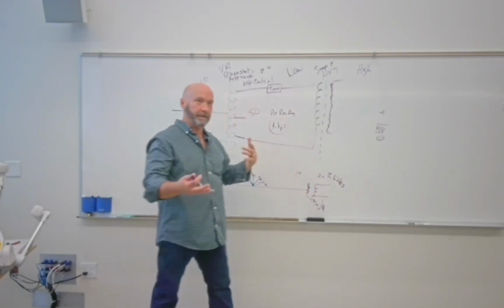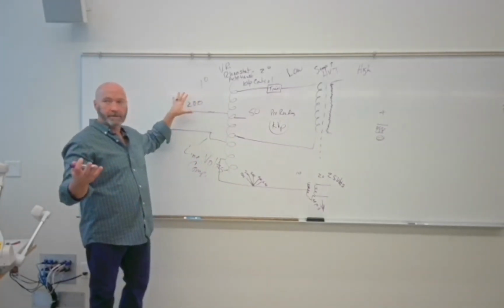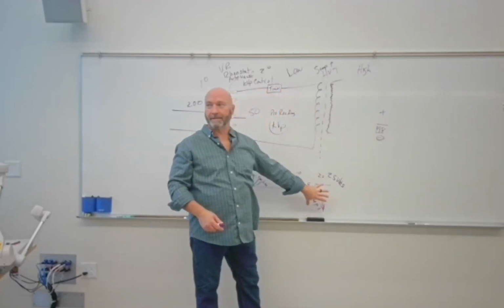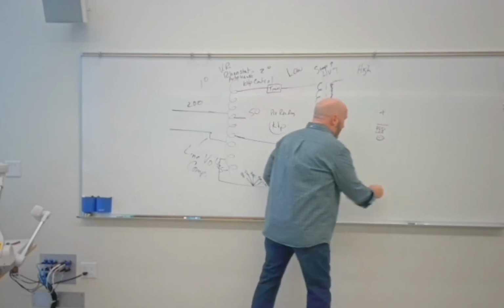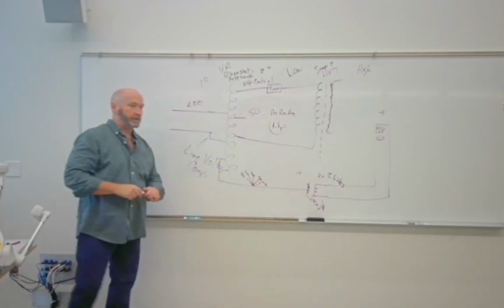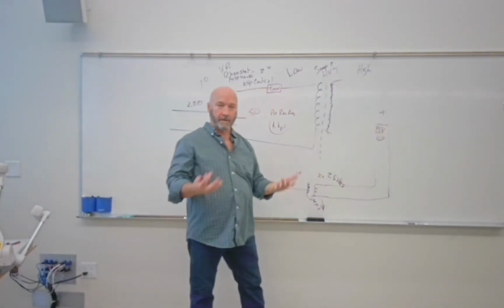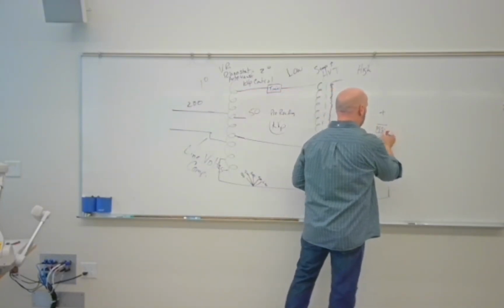Here you've got a lot of power, and in our analogy, this is your Mustang, Corvette, whatever. Especially after it goes through this, down here what you've got is a bicycle, right? It's just not going to push them across. So it comes out of that and it goes into our filament. The purpose for this circuit down here is to do two things. The primary purpose is to provide electrons to our filament to create our space charge.